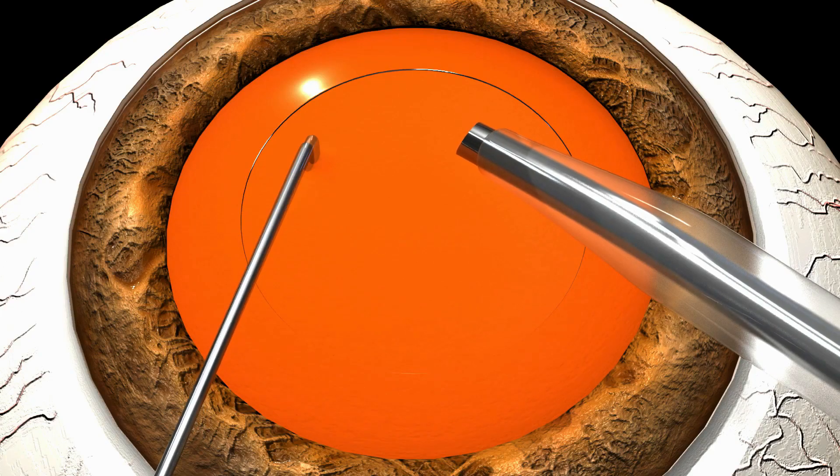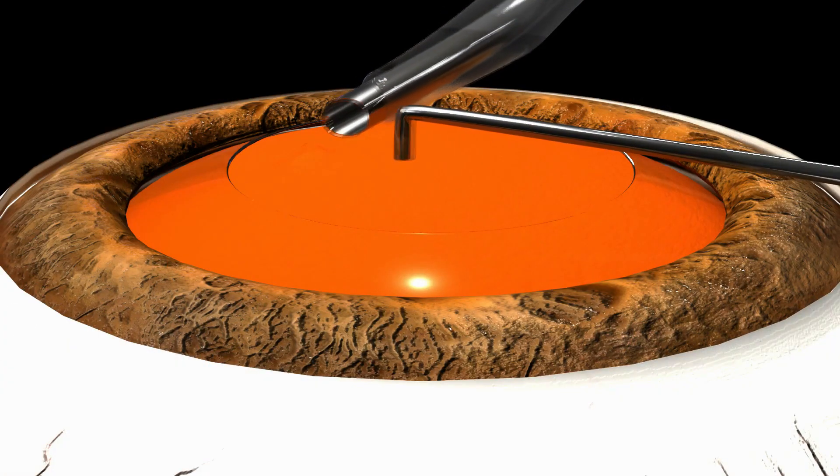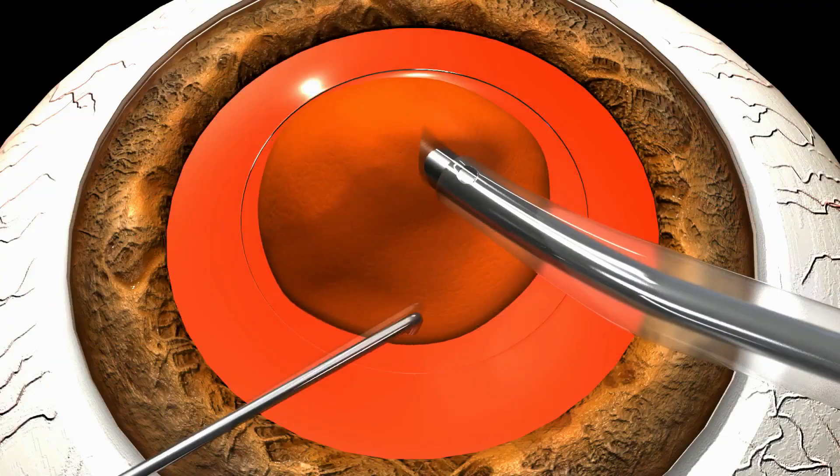Animation shows the nuclear rotation, sideways alignment of the tip with placement at the nuclear rim, and impaling and devouring of the nucleus.